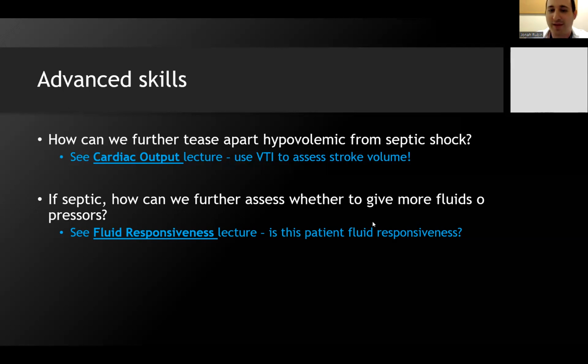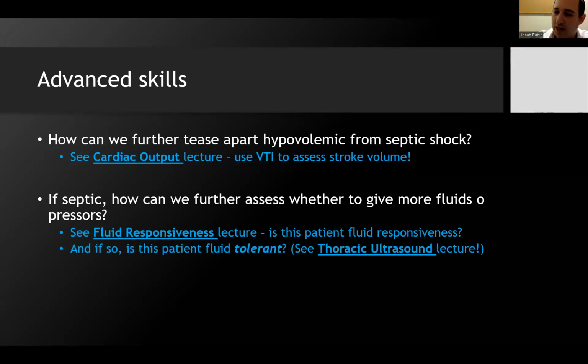And then the other thing, though, of course, to remember whenever you're talking about fluid responsiveness is also assessing if the patient is fluid tolerant. And one of the ways to figure that out, certainly not the best way, is to use a thoracic ultrasound. But really, you're right. You want to make sure that by giving fluids, it's not going to just flood the patient's lungs and then create a different problem.